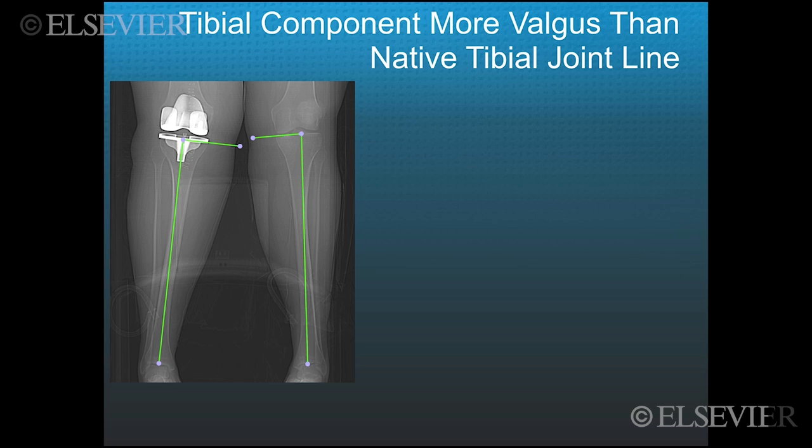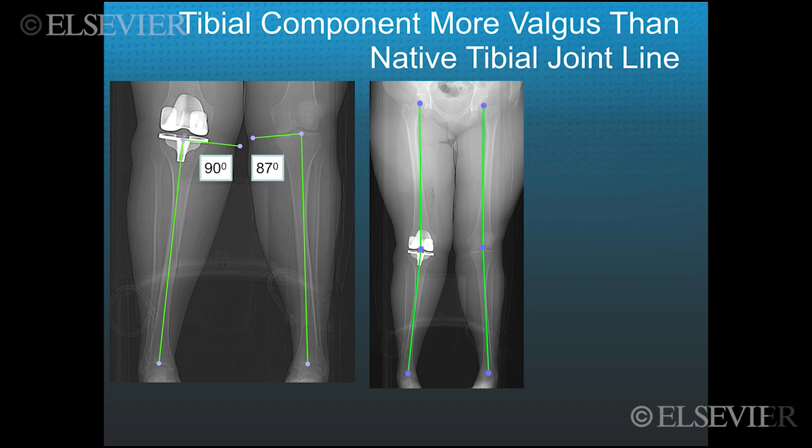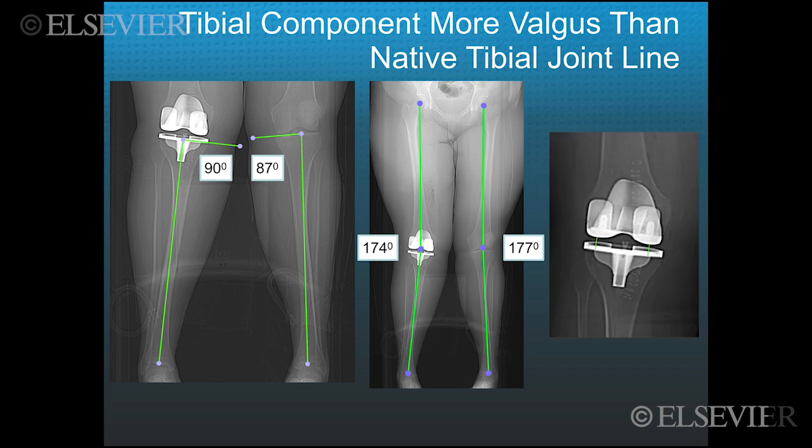She has a large leg, as you see here, so the big soft tissue envelope interferes with your ability with your hands to assess laxity. You're better off looking in and directly visually looking at the displacement between the spacer block and the distal and proximal femoral and tibial cuts and with the components. So we left the limb in 3 degrees of excessive valgus. She didn't like that. The other leg was 177. There's no arthritis. And so once again, you can see a little asymmetry even on the postoperative radiograph or scanogram.